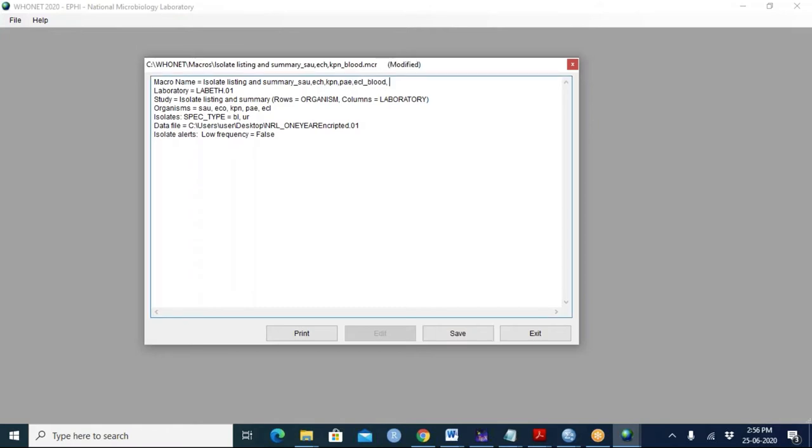There's one other thing that we can do here. After the false, you see where it says false? Hit enter, and hit enter again. Type begin analysis. Is it ES or IS? IS. It's the same as the name on the button. Okay, hit enter.